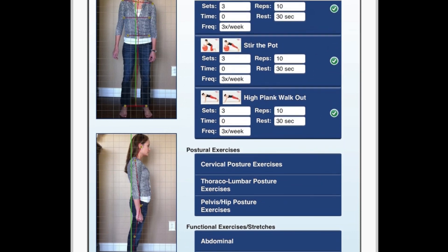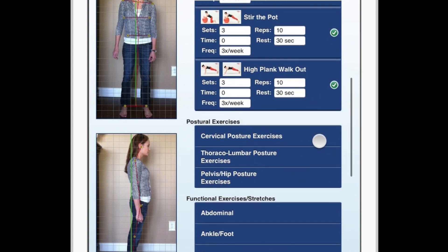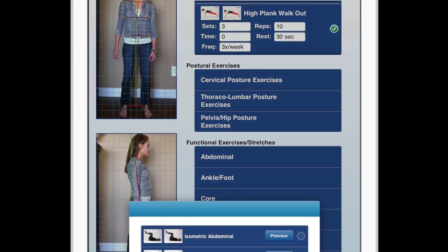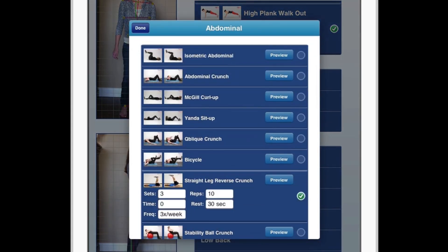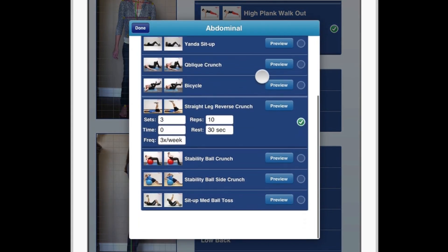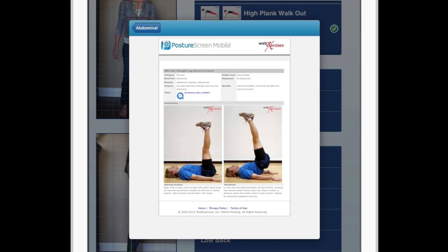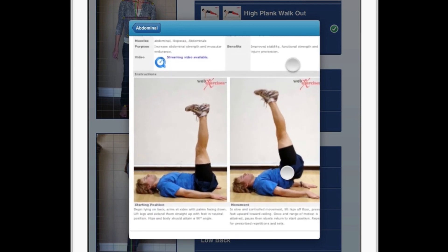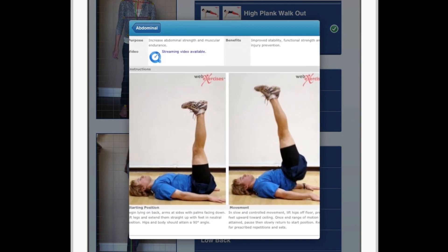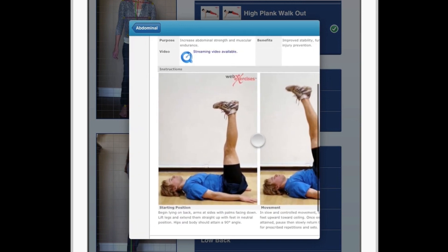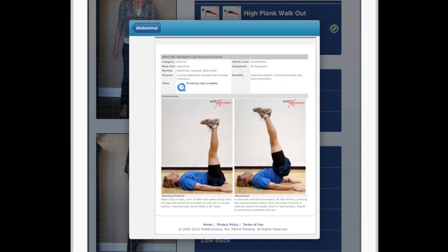If you would like to see what an exercise is, from this menu we can also go ahead and preview any exercise. For instance, if I wanted to go into the abdominal exercises and preview one, all I have to do is click Preview. It will call up the web exercise server, and there is the exercise prescription.